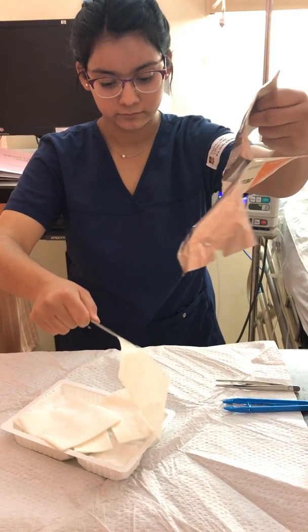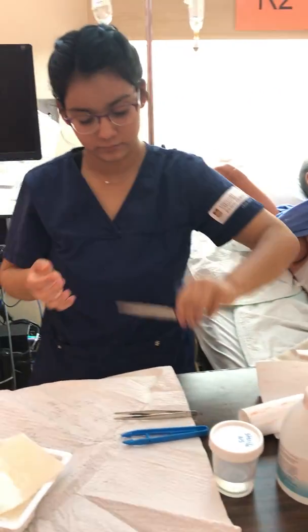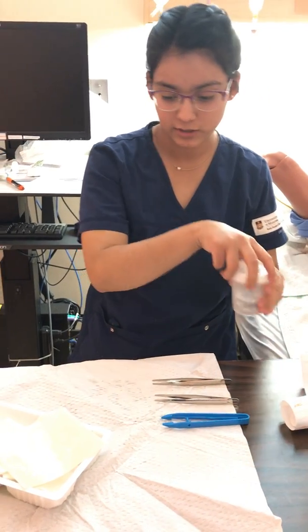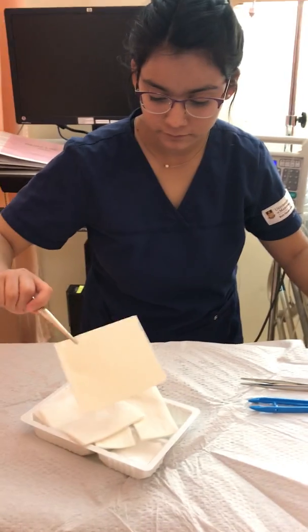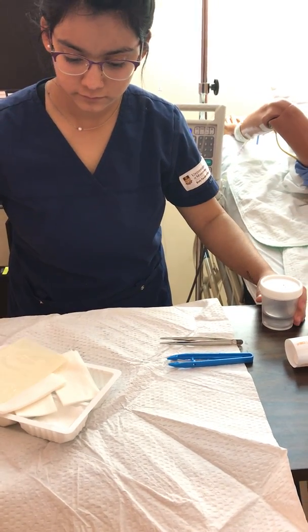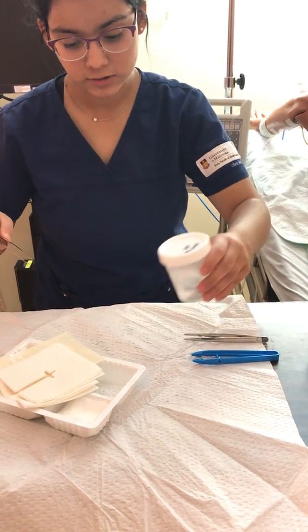So now I'm going to stabilize, and I'm going to take out the old dressing, making aware of my 1-inch borders. Now that I've added everything, I'm just going to add my normal saline. Before I do the suction, I'm going to pre-oxygenate this patient. Stabilize it over there. Mr. Fredrickson, could you? Sorry, I'm just taking this out.